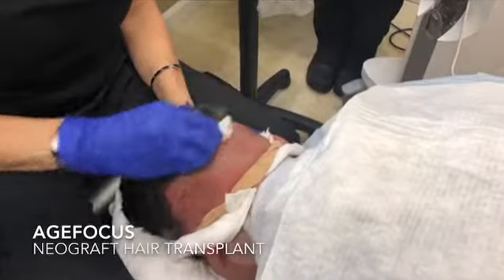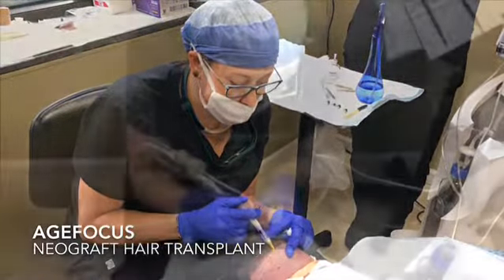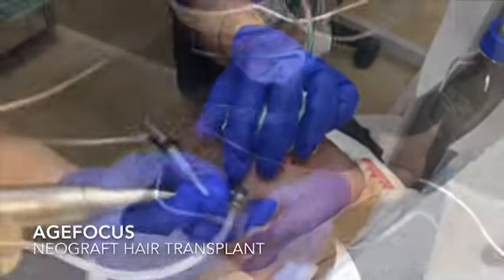Today, AgeFocus is performing a minimally invasive NeoGraft hair transplant procedure. This four-step procedure begins by shaving and numbing the scalp in the donor area, usually located at the back and bottom of the scalp.